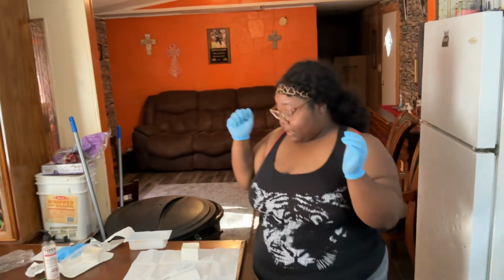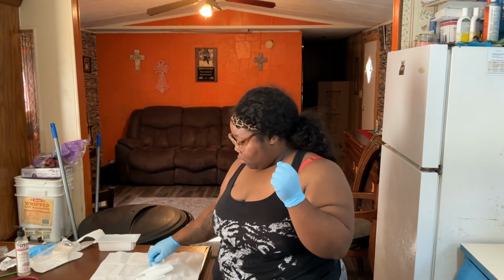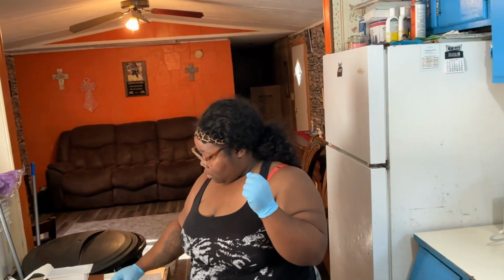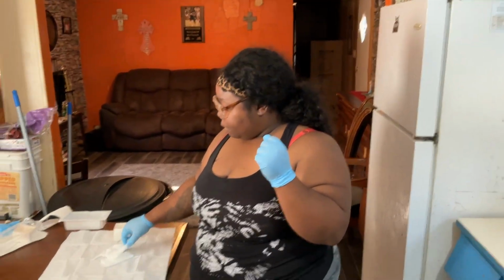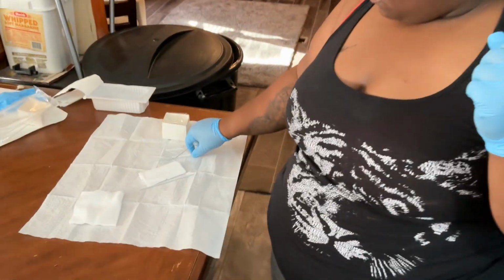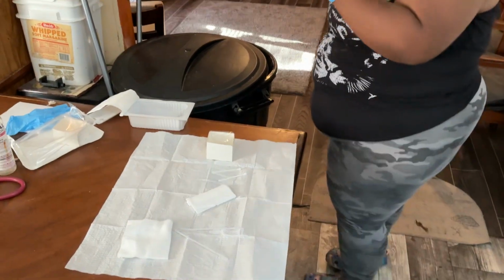Okay. This is my dirty hand, this is still my clean hand. I'm going to take my brush here. This is getting stuck to my gauze. It's okay. I'm still sterile in that hand. So it's okay. Okay. Alright. This is my dirty solution. This is my clean solution there.